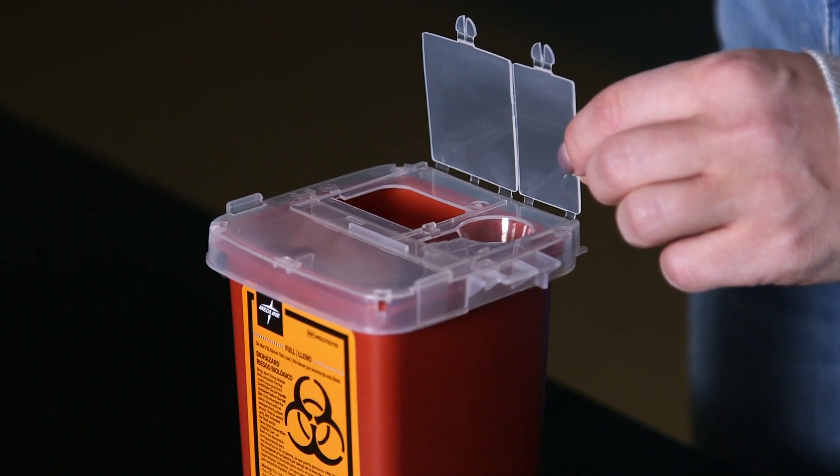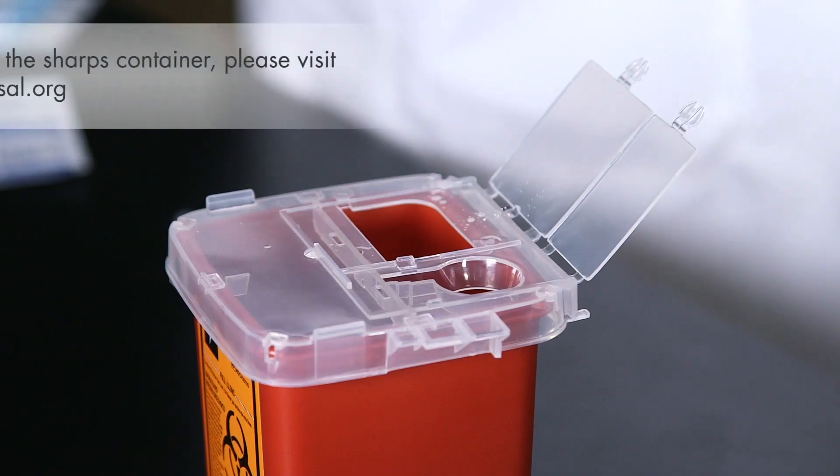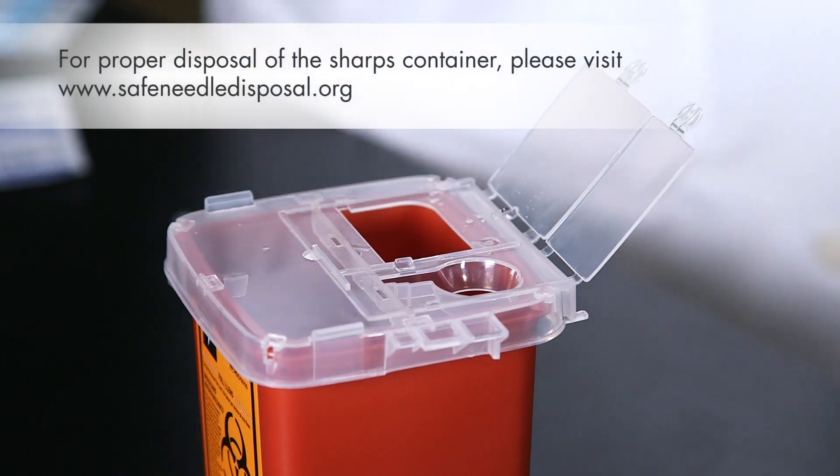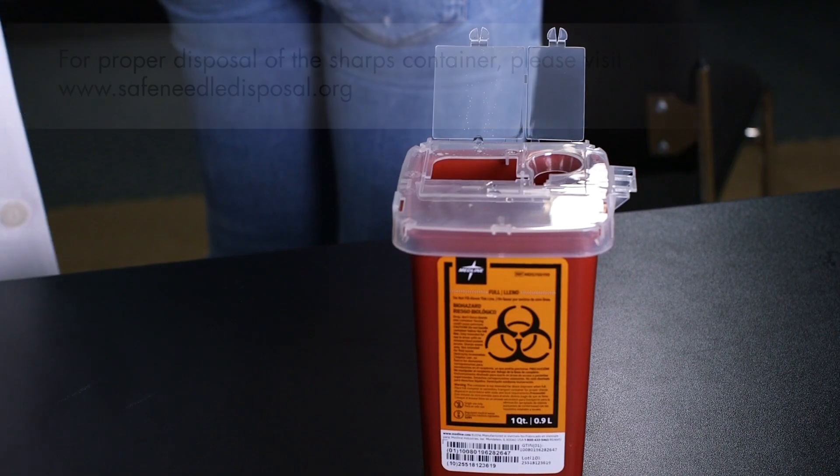The sharps container comes with a permanently sealable top. Open the lid — you don't have to recap the needle. Just drop the needle and syringe into the sharps container. You can close the lid, but do not seal it until it's full.